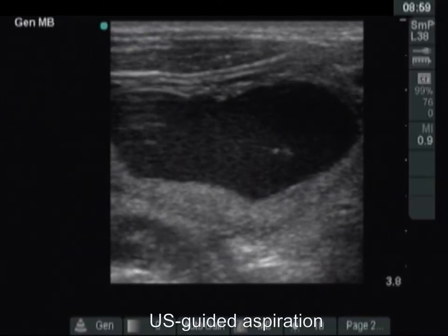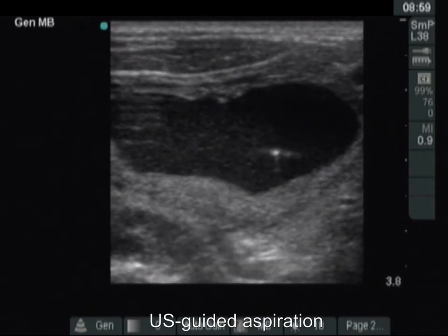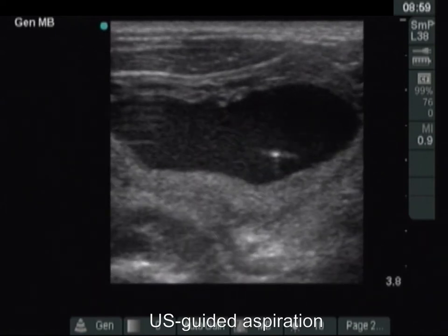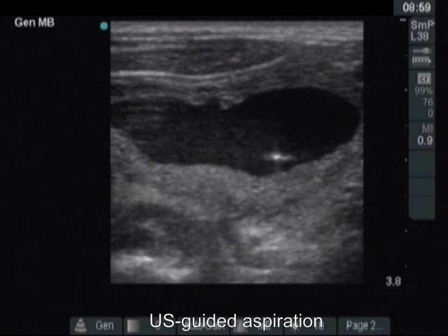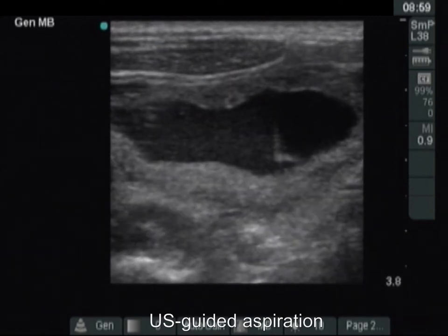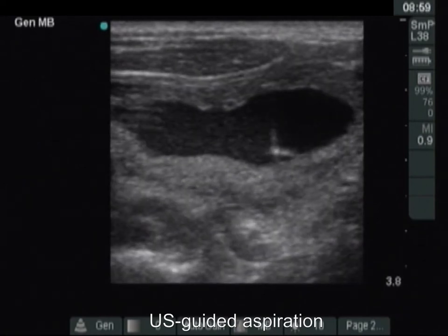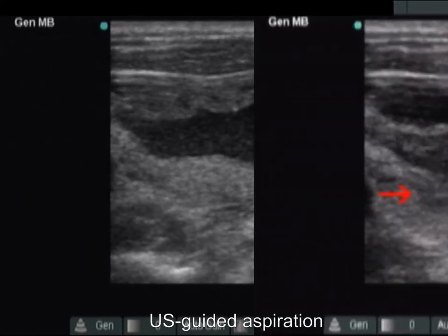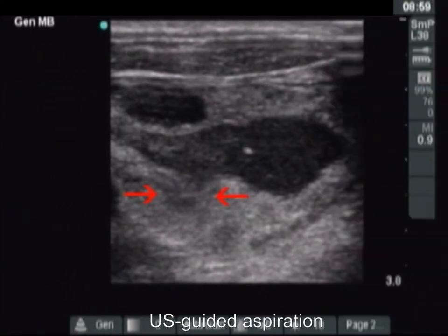We present the first phase of the aspiration. We aspirate the largest chamber. The stream of the cystic fluid towards the needle is demonstrated. We try to empty the entire contents of the cyst. We can see the tip of the needle within the cystic part. The two arrows point to the region of interest.